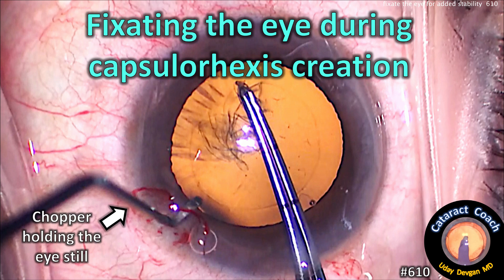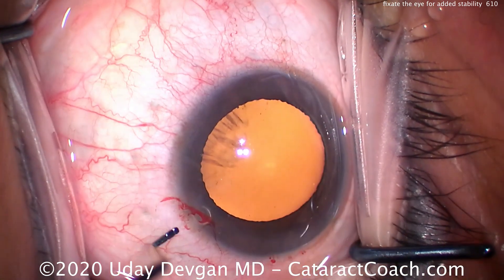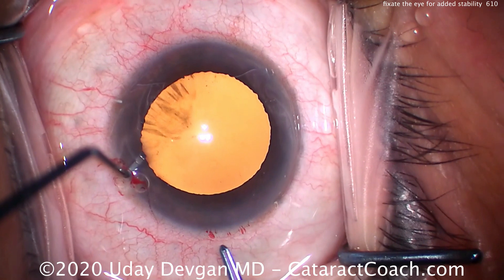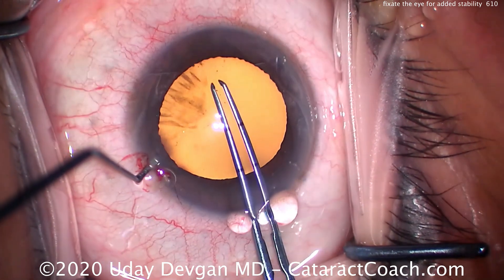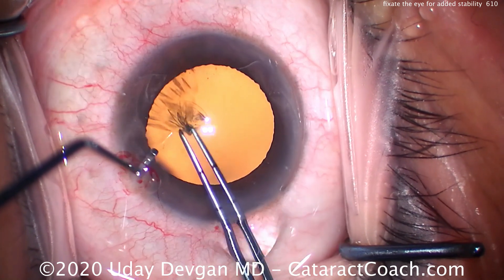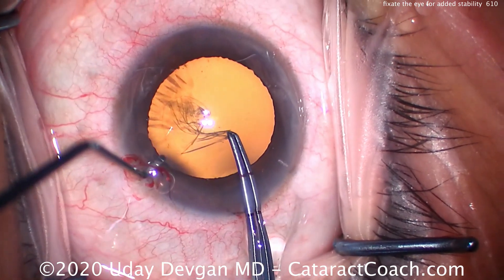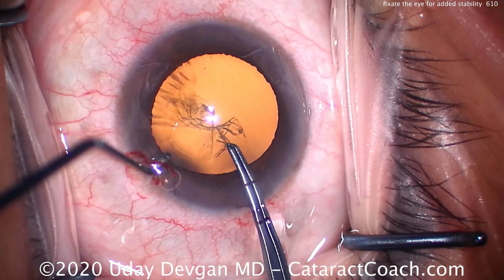This is an important technique. This is a patient who's less than cooperative, and because of systemic issues, the patient is unable to receive more systemic sedation. So we're going to use the chopper through the paracentesis to really fixate and hold the eye still. That prevents the patient from moving the eye so we can do our capsulorexis.